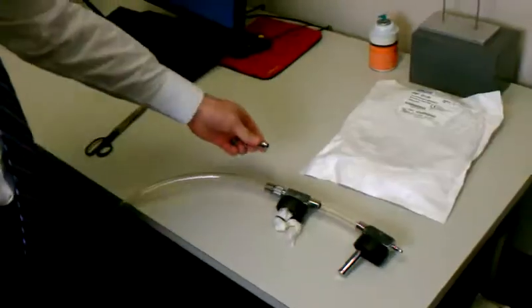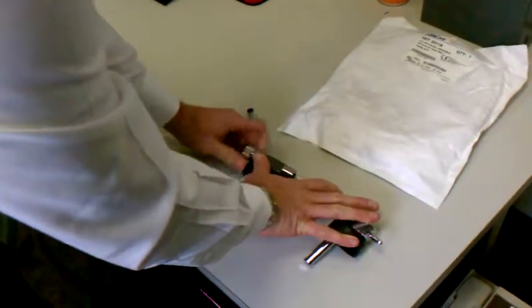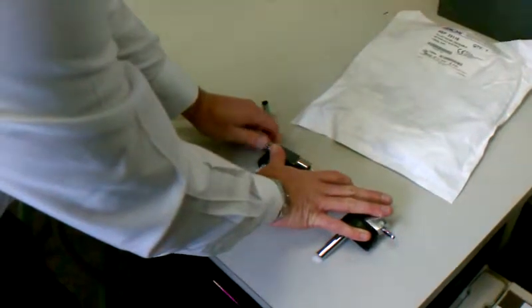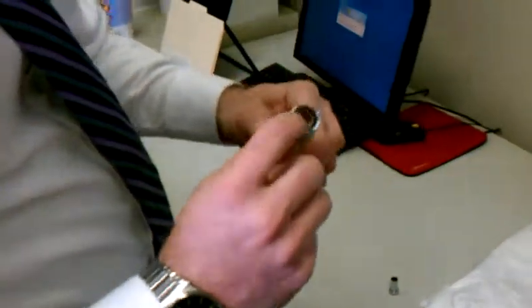The first thing you'll notice is that from the factory, there's a half-inch tubing set up for reusable curettes, and so it comes with this half-inch nipple on it.